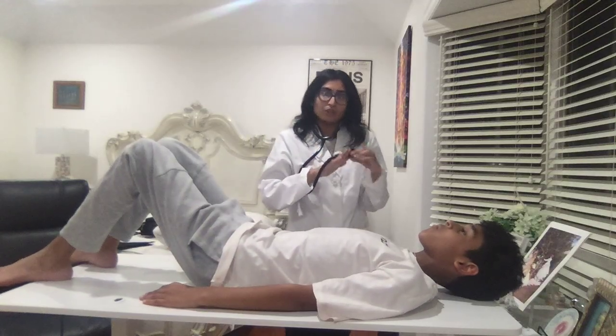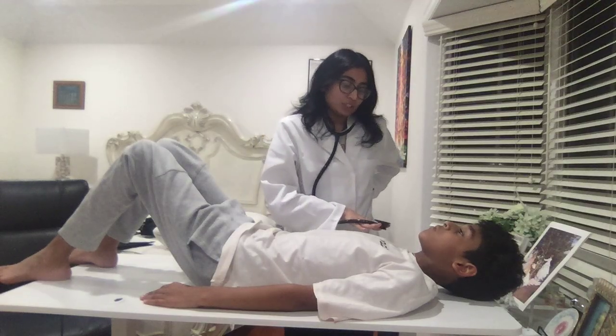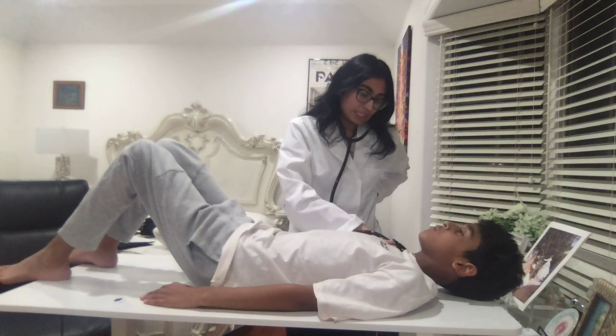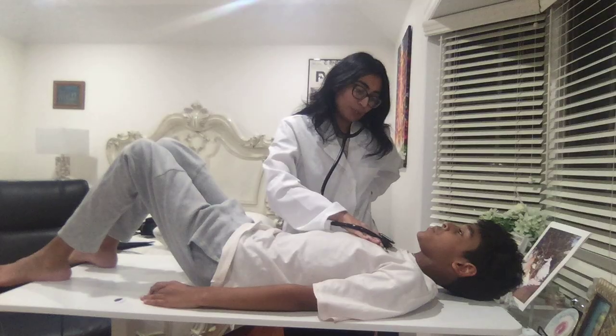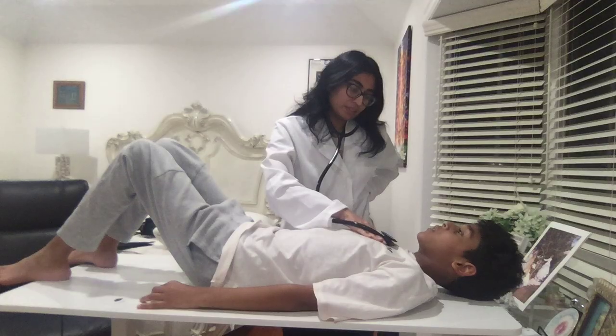And now we are going to auscultate all of the same regions using the bell of the stethoscope. So again, the right second intercostal space peristernally is the aortic valve. Then the second intercostal space left peristernal, we are going to listen to the pulmonic valve. Then again, for the Erb's point, which is the third intercostal space, would you please take a deep breath in for me and let it out?